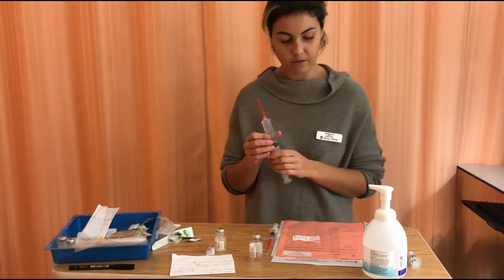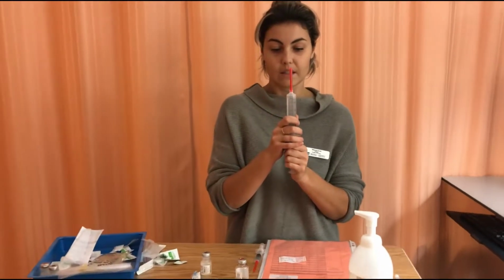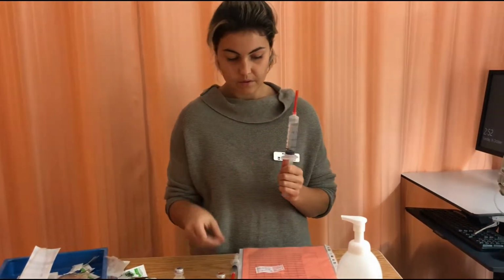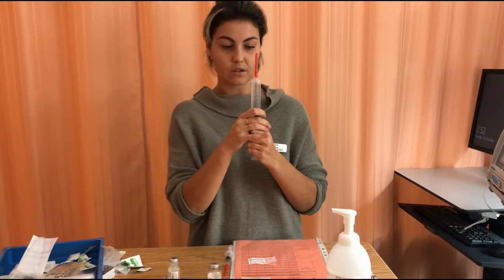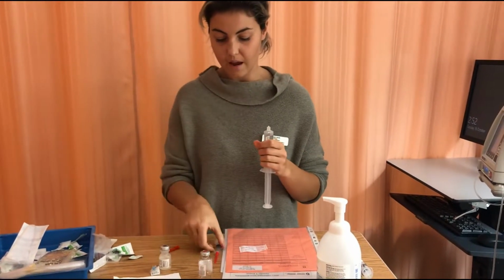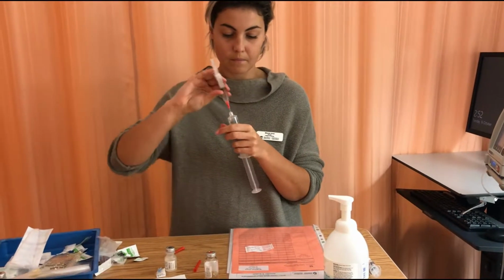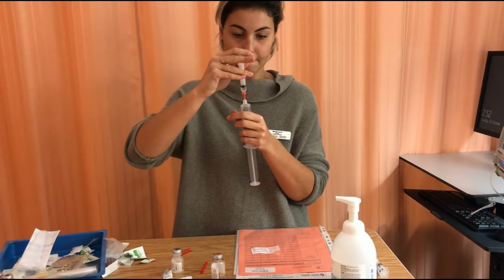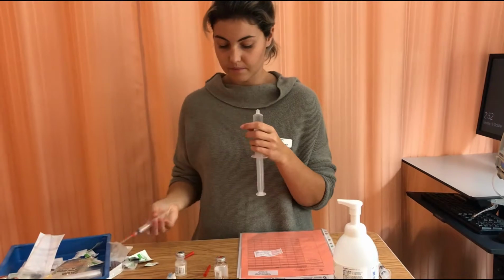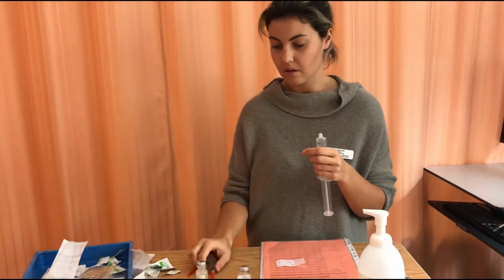Now I will place the remaining syringe into here, removing the cap, maintaining sterility. And this would just be recapped and placed in the sharps.